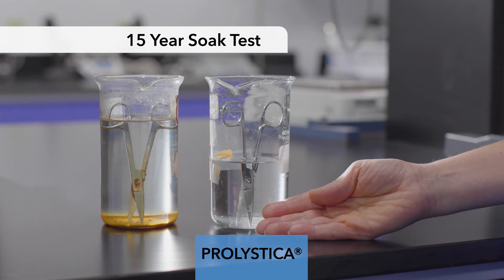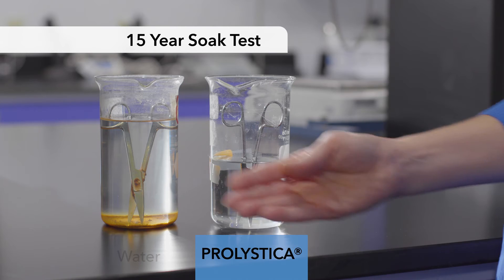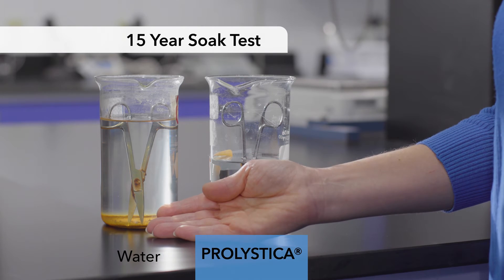To compare, here are scissors over the same 15 years in just water. Water alone can be very damaging to instrumentation. The oxygen in water causes oxidation to different types of metals. Our specialized formulas protect instruments from water damage by maintaining the passive layer of metal on each instrument. Prolistica protects from the damaging effect of water by using patented combinations of corrosion inhibitors and chelating agents.